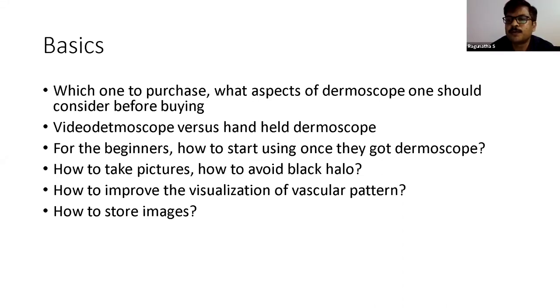Dr. Enzo, how do you store the images? Yes, we have dedicated cameras. At the end of the day, we download all the images and put them onto the computer, and then we have the storage. I would like also to comment on another question: how to improve the visualization of vascular pattern.